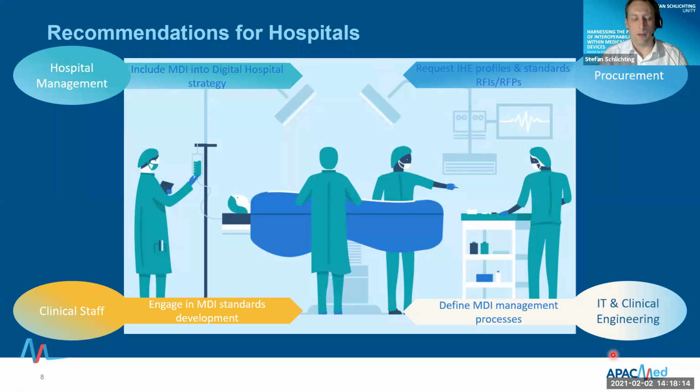So, for example, one of the big portions, if we look at the scenario that we have described for getting the data from the outside, so from the diabetes or the glucose monitoring system into your EMR: for that purpose, there needs to be an interface, of course, so that you can ingest this data into your EMR. This has to be managed. And of course, all the cybersecurity aspects for these open interfaces have to be managed as well.